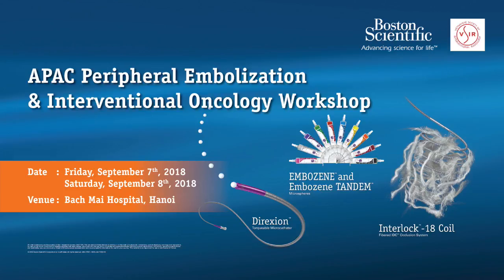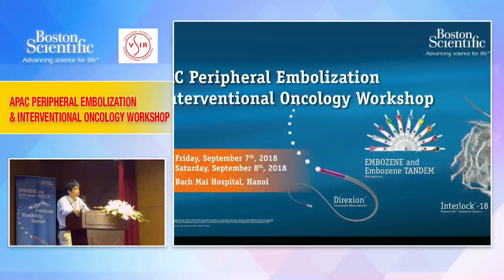It's short term. Yes, we follow up the patient in the short term, that means 2 weeks after the intervention, while the patient stays in the hospital. And the reason is that after the embolization, the bleeding is stopped, and that makes the patient happy and the surgeon very happy. And we were afraid that maybe there would be hypertension after the embolization. So right after the intervention, we ask the opinion of the cardiologist, who comes in to give some medication for the patient to control the hypertension. And that's why this patient doesn't have hypertension.